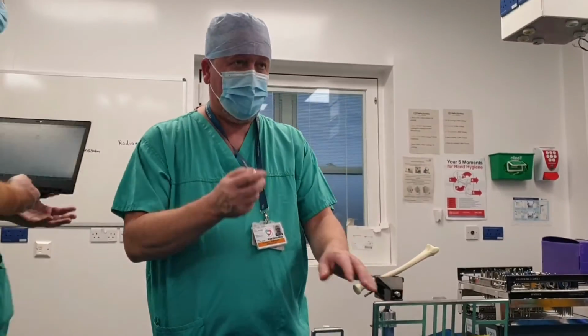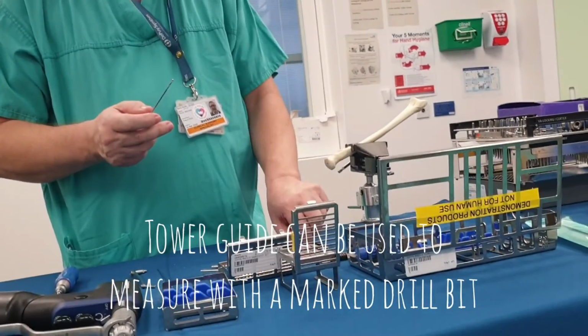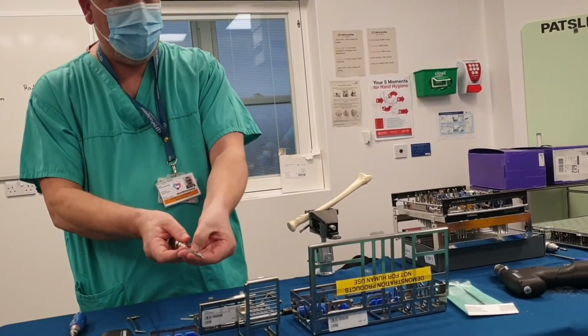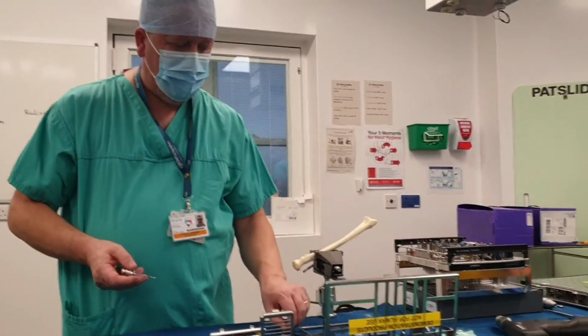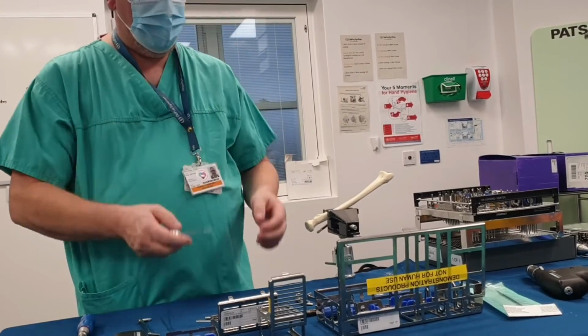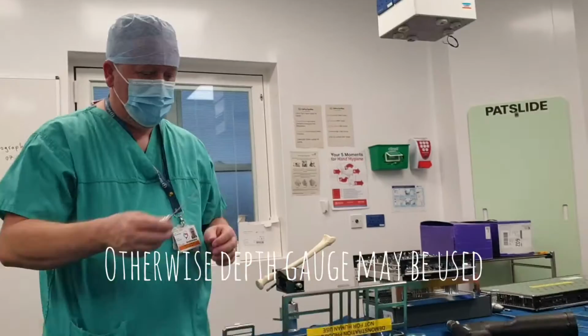The drills on the set have a calibration. You see a little marker. So when you use the tower, when you put it in, you can actually see and measure. Oh yeah, we don't have a drill bit on the set. We use disposable drills. Your sterile drills don't have that, so you have to actually use the measure. So it just makes it easier.